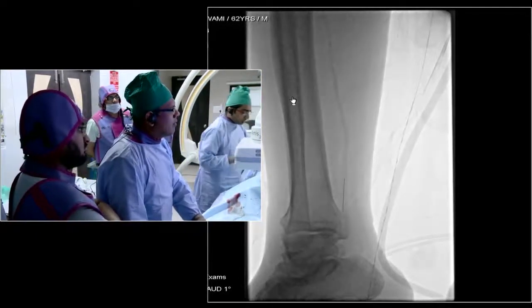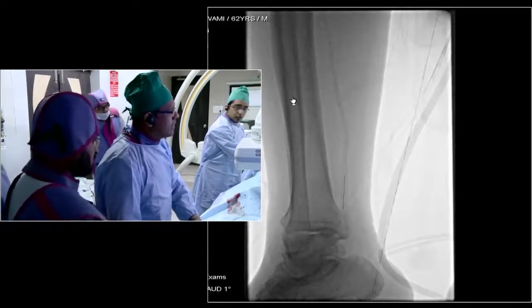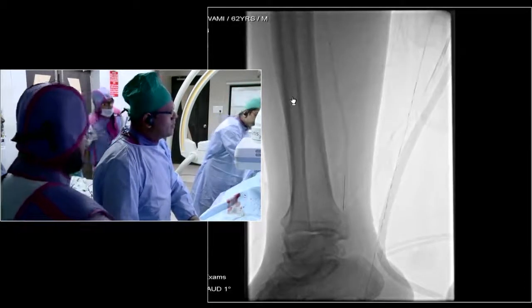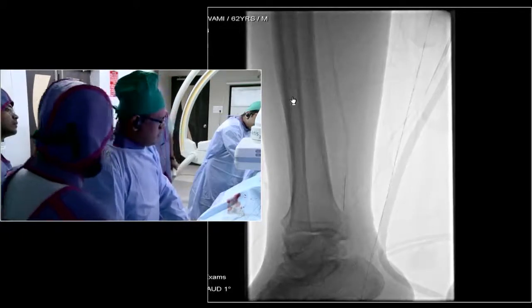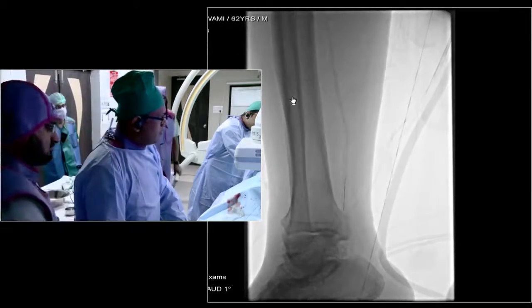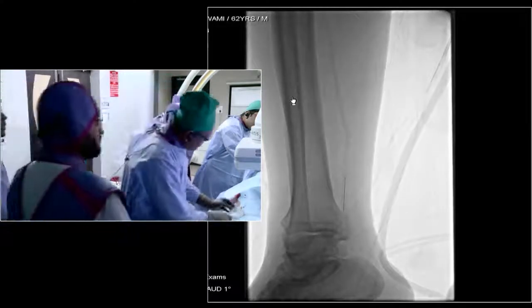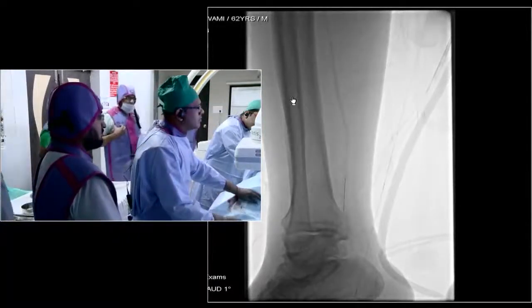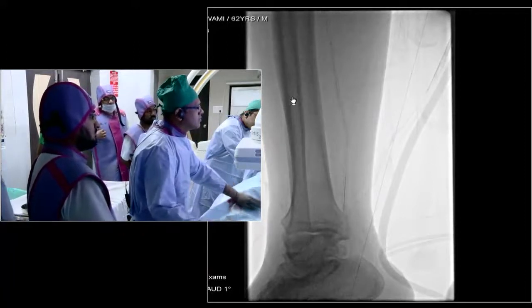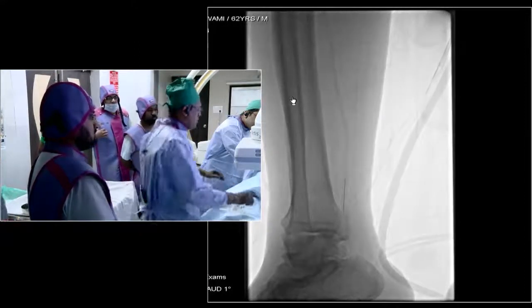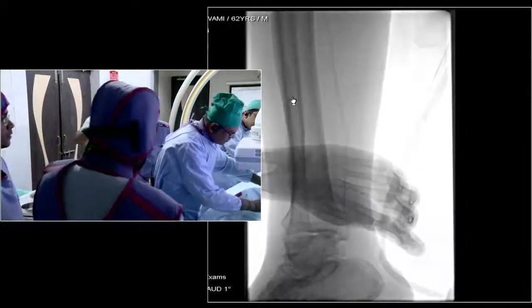I've got the wire. Hold it tight — one person holds the wire while somebody pulls out the catheter. You always require two people to do this procedure. Losing the wire is a big challenge because you have already angioplastied that segment.